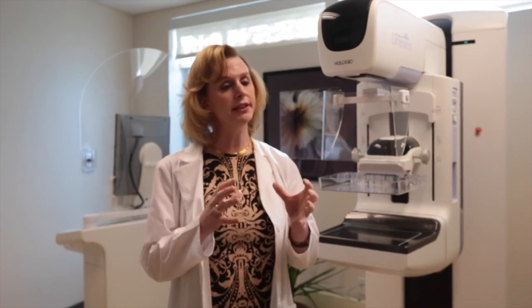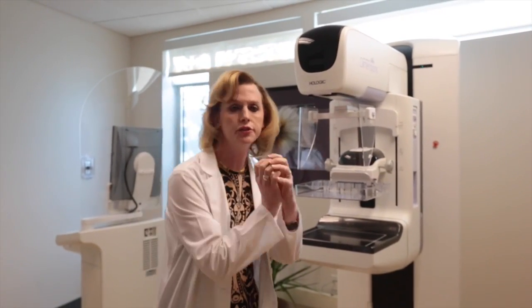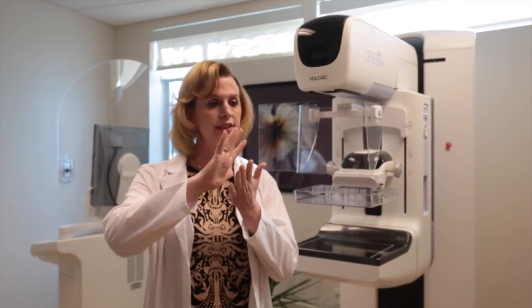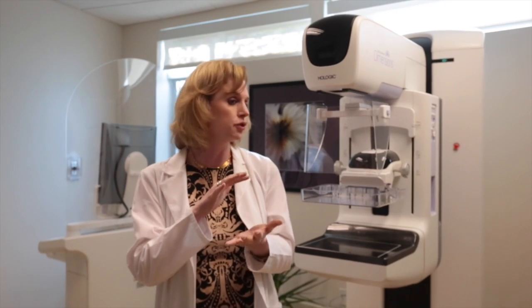The other major advantage to 3D mammography over 2D mammography is that with 2D mammography, we'd have to call patients back because we'd see a density in the breast on the standard 2 views that we took, and we'd say, is that density something to worry about or not? And we wouldn't know just based upon those 2 views. And so we'd have to call the patient back and do some additional views. We'd either have to roll the breast to try to roll those tissues out of the way, or do spot compression views of the breast to try to squeeze the tissue out of the way so we could see if that was a true lesion or whether it was just overlapping structures.